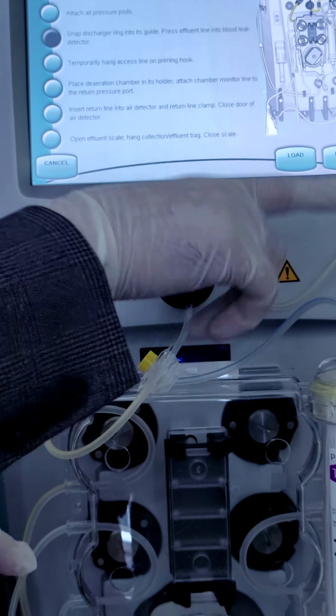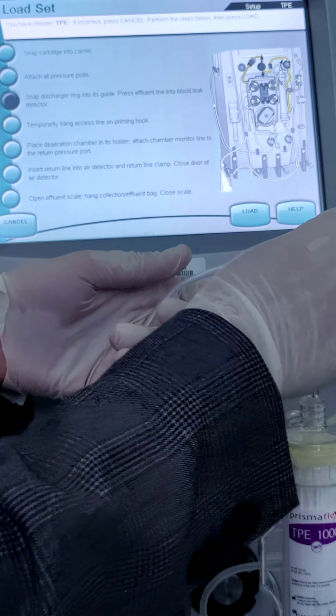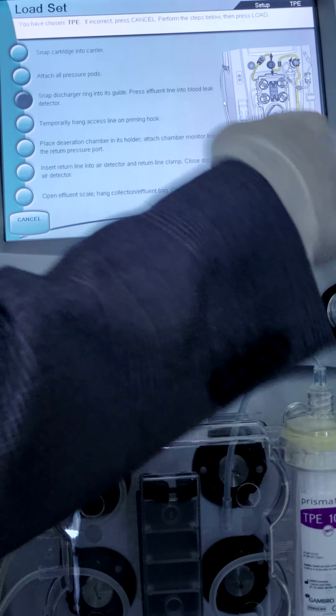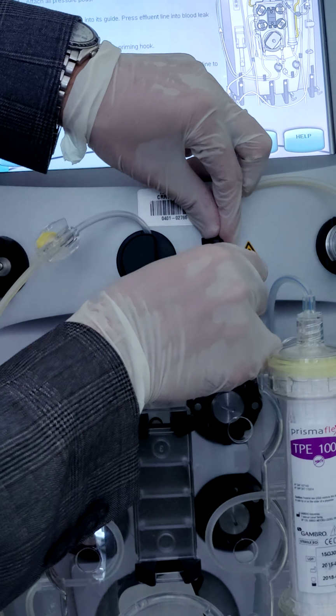This one is wrong, okay? Yes, this is wrong. The correct way is like this. This arch is not here. It won't keep the arch. Okay?